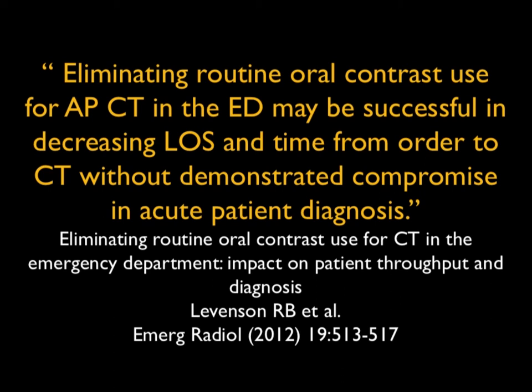Well, the fact is, a lot of it depends on how efficient you are or aren't. If you're efficient and you get the patient down within the right amount of time and you give them oral contrast, you're not going to typically have a problem. But again, if you're twiddling around, if you're inefficient, if a case doesn't get from the scanner to you in 3 hours, you indeed have a problem.